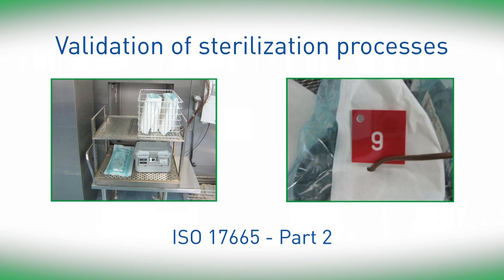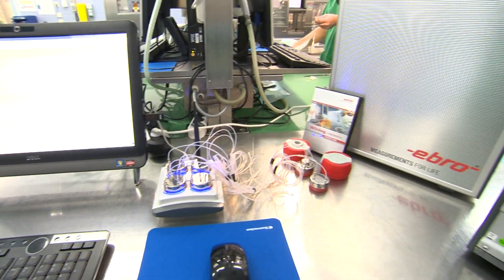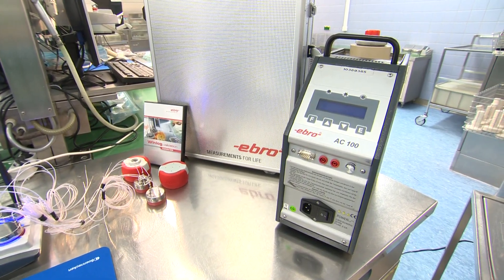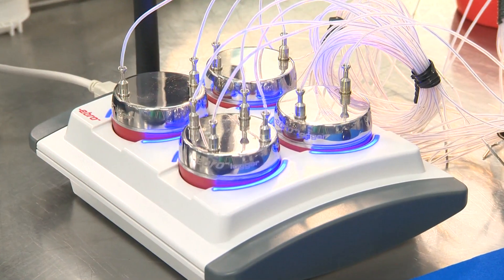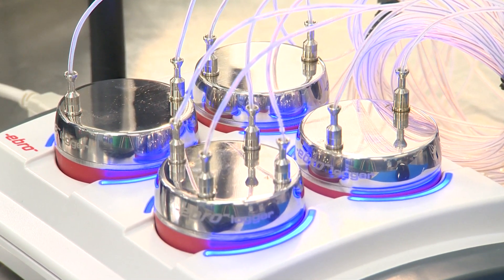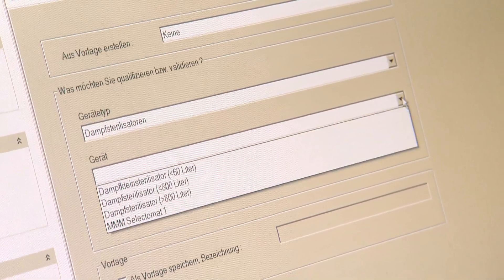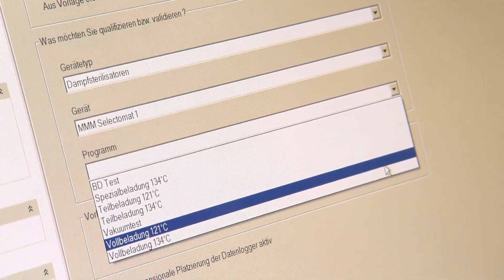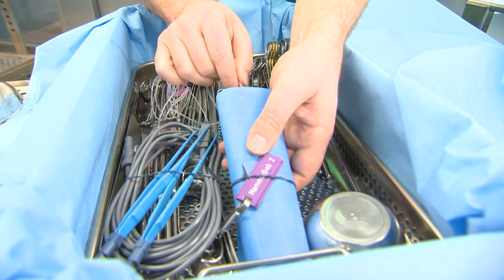Details regarding the validation of steam sterilization processes are provided in ISO 17665, part 2. An important part of the validation procedure is the measurement and logging of the pressure and temperature in the sterilizer during the process. To validate steam sterilization processes in large sterilizers, up to 12 temperature sensors and one pressure sensor are used. After the programming of the data loggers, the temperature sensors are placed at the critical points and at the reference sensor probe of the steam sterilizer, as well as between the loading items.